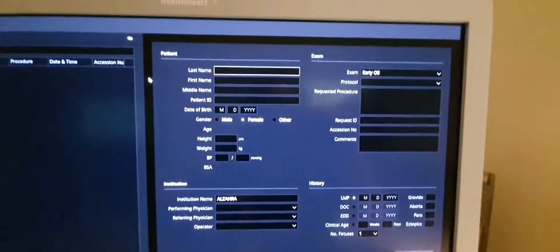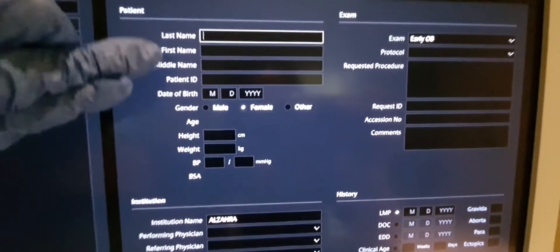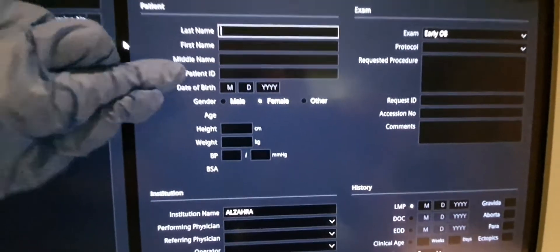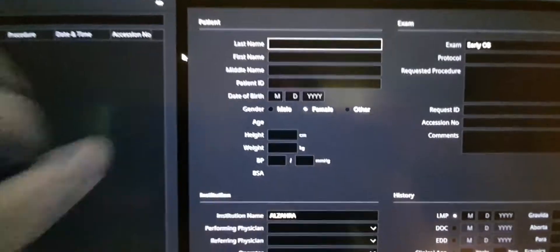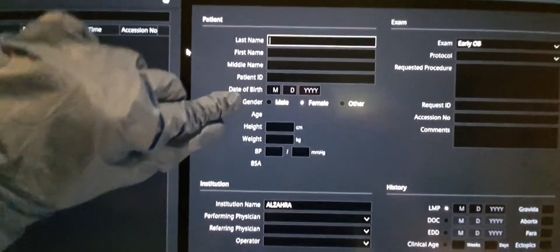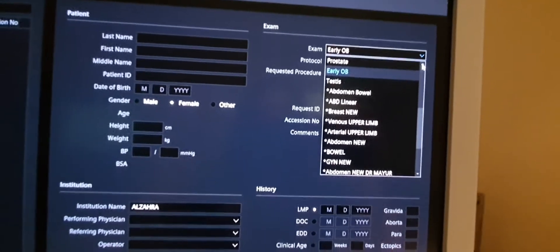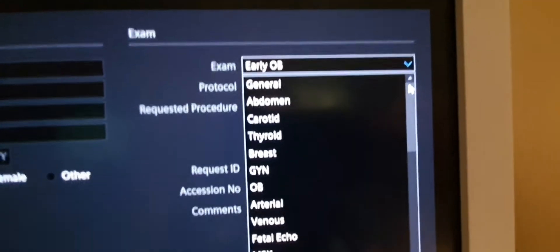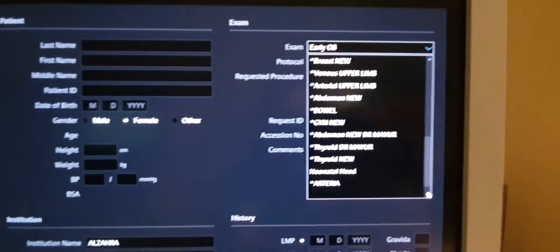Sometimes you need to enter details manually. The important things to include in the patient details are the last name, first name, patient ID — make sure the patient ID is correct, otherwise images will be mixed up with another patient. You also need to input the date of birth, gender, and select which type of exam you're doing: abdomen, carotid, thyroid, and so on.